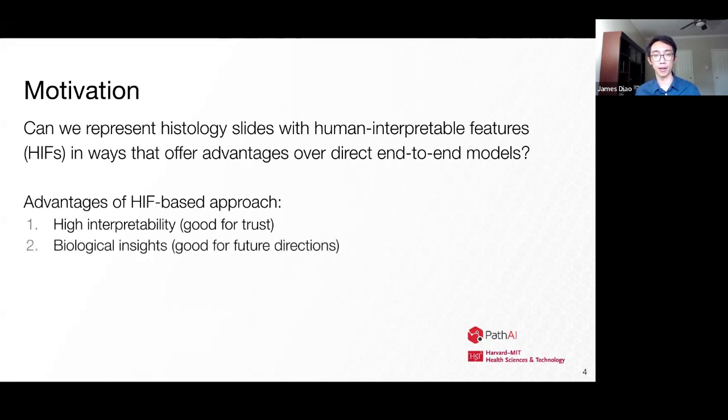Another advantage is being able to quantifiably and scalably connect the predictions directly to biological entities, which is potentially helpful for future investigation. And then it also defines this hypothesis space of areas that the machine is allowed to learn, which enforces an inductive bias that on the one hand limits overfitting, which can be good, as it can get in the way of the machine cleverly learning spurious associations that might not generalize, but also, as you know, can potentially lead to underfitting as well.